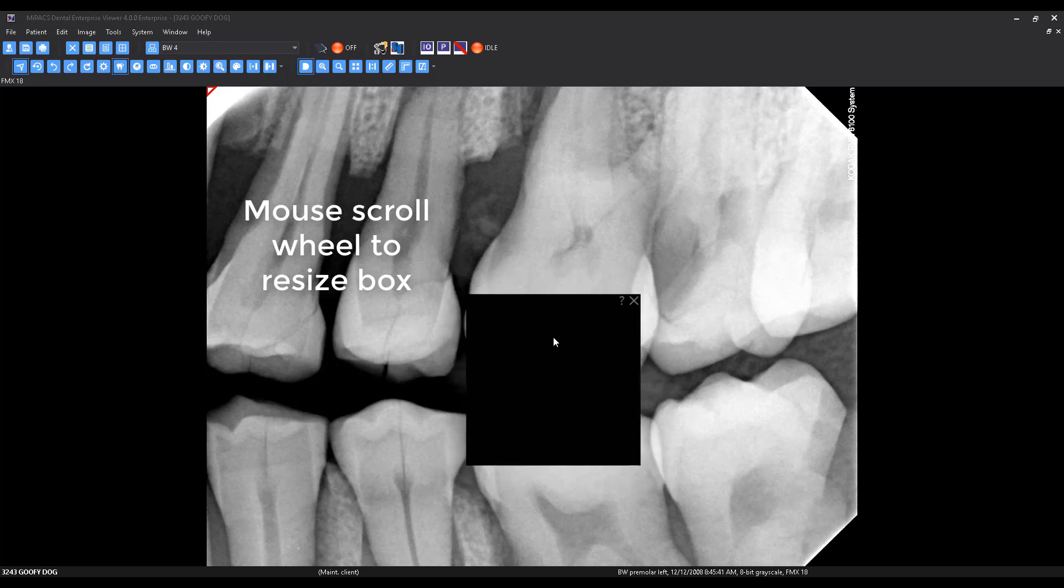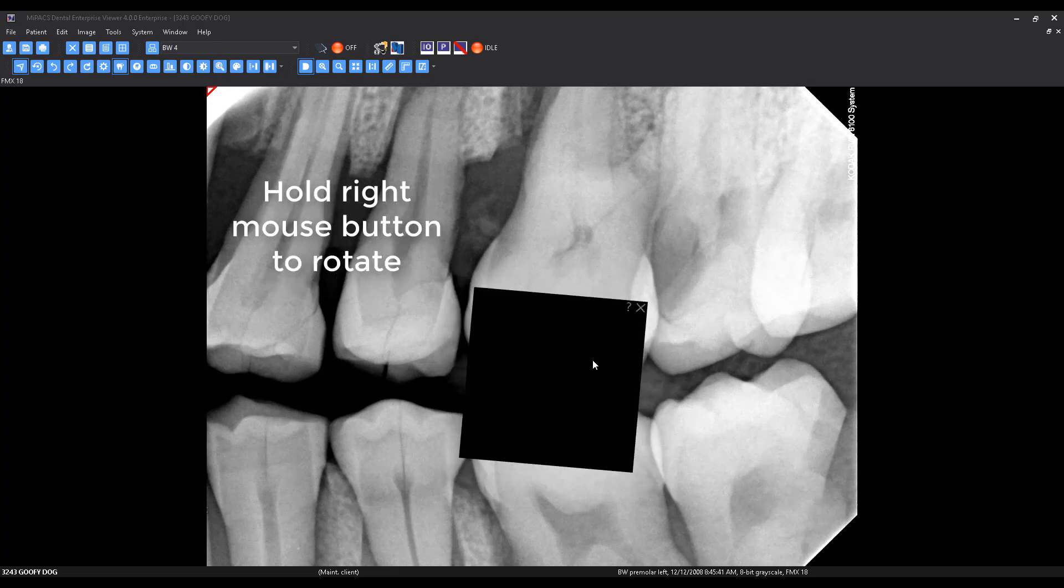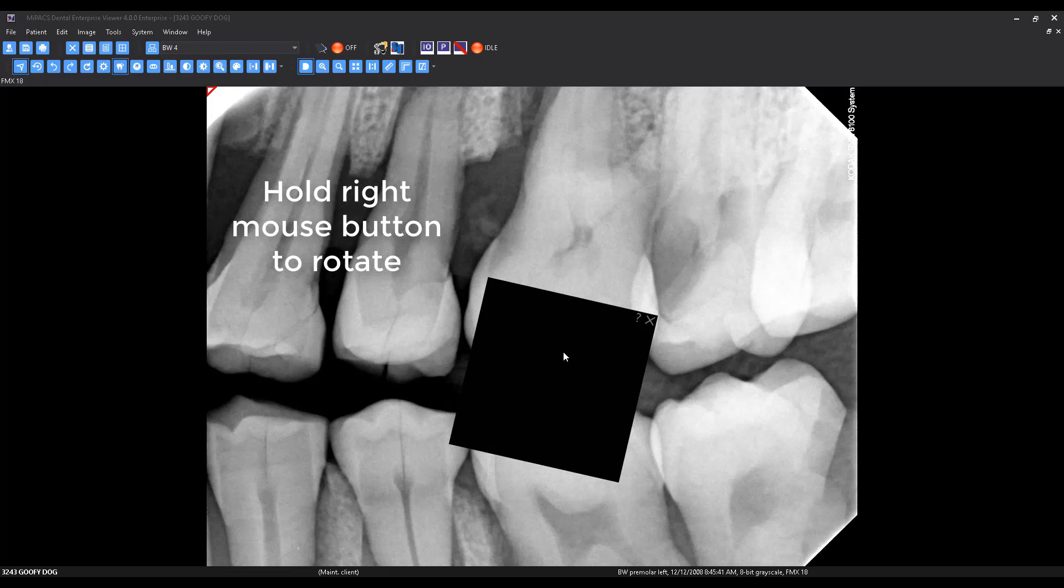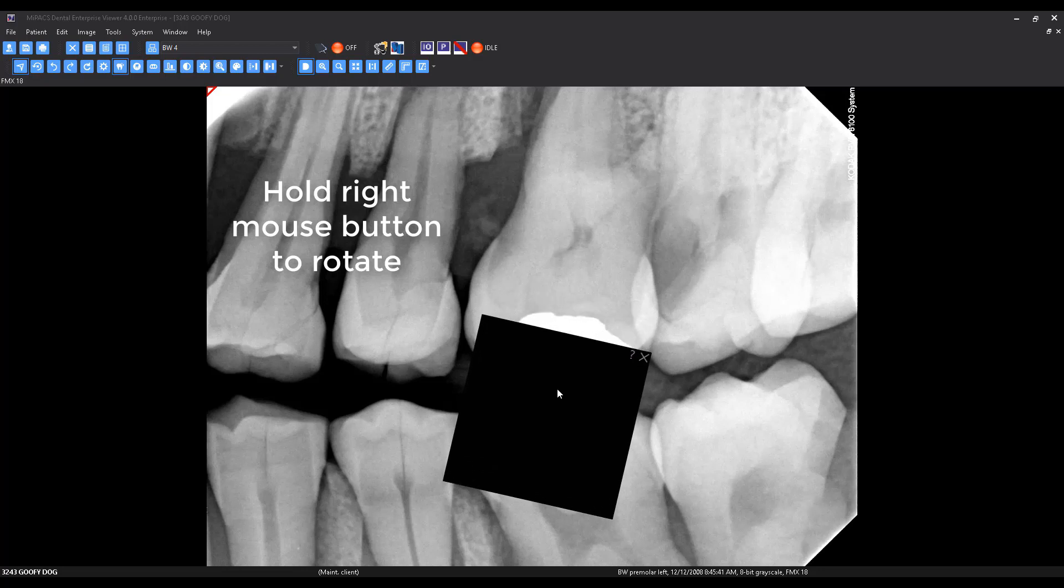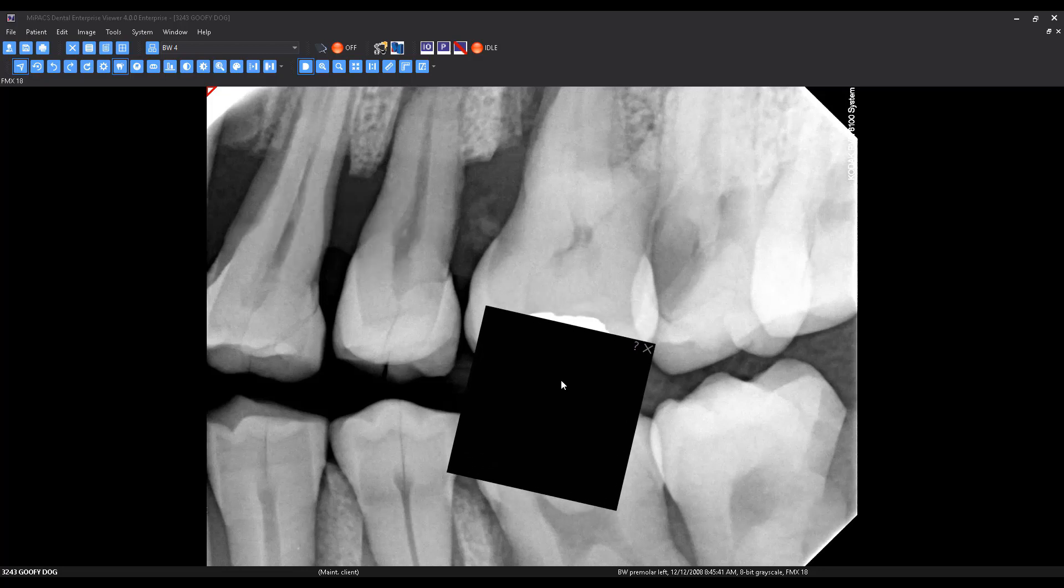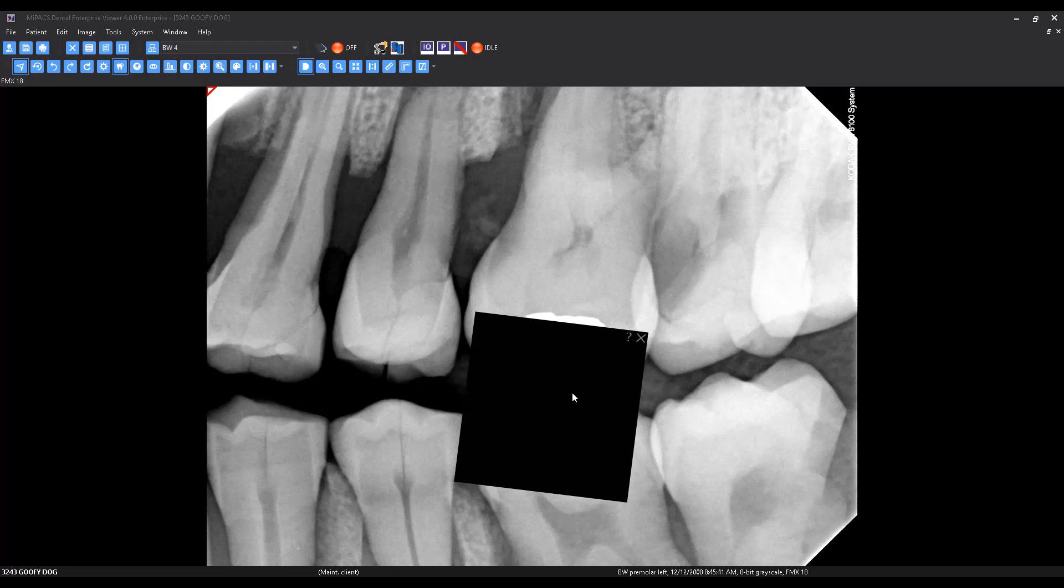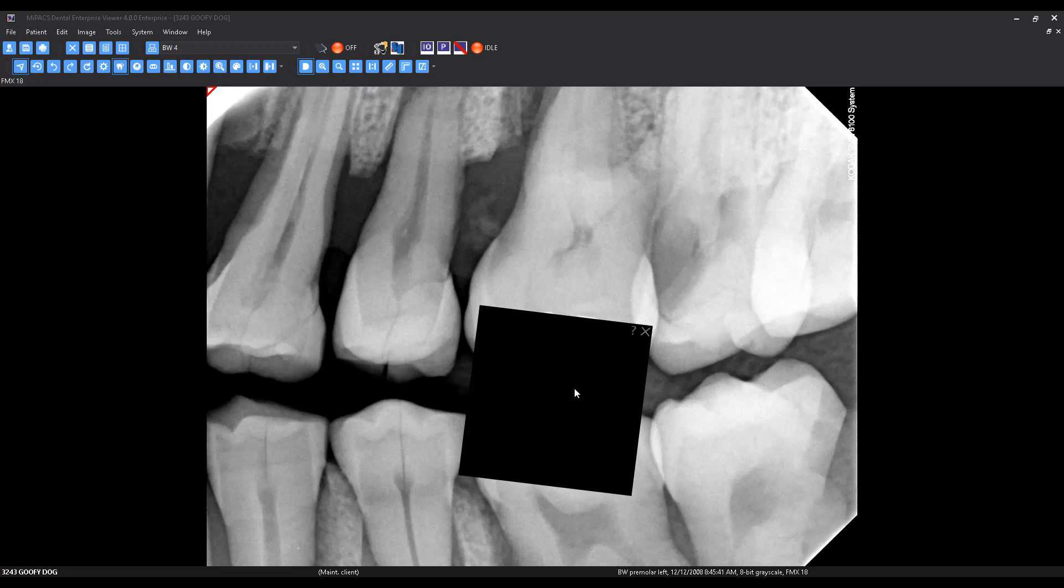You can adjust the size of the Mach effect tool using the scroll wheel on your mouse. You can also adjust the rotation of the Mach effect tool by holding the right mouse button down.